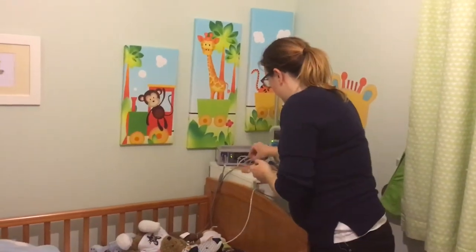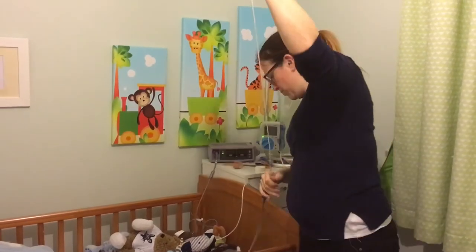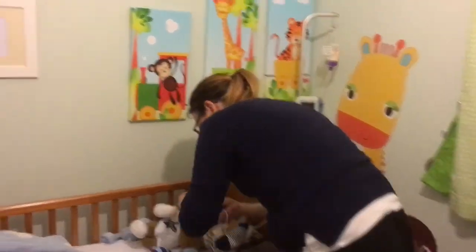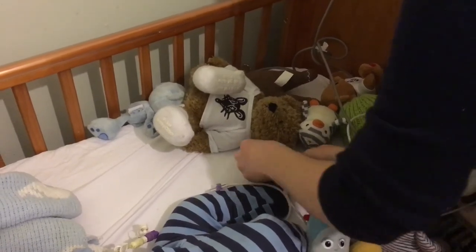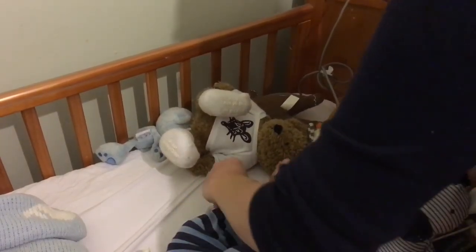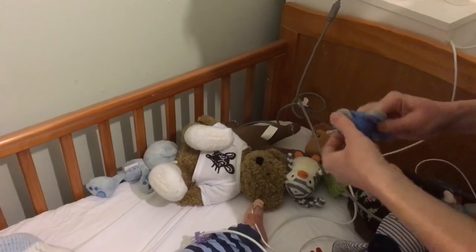The next thing we have to do is attach him to his oxygen monitor. Here we have the tube wire that connects him to his oxygen monitor — a little probe on the end that just attaches to his toe. We have a lot of problems with this, so generally we put a little sock over him because that keeps it on a bit better. I'm just going to attach this to his toe and then a little bit of plaster that sticks to his foot just to keep it in place, and then we put the sock on over the top.